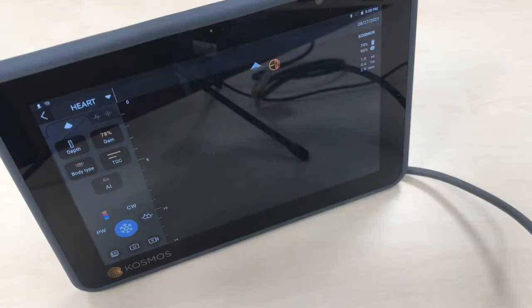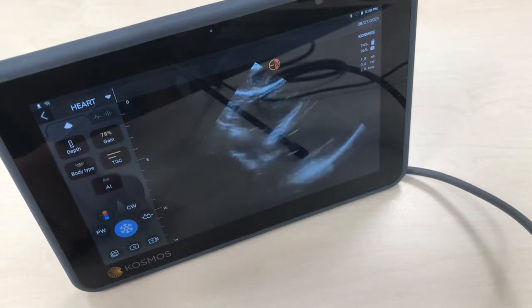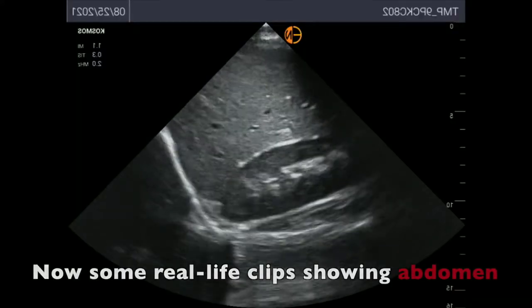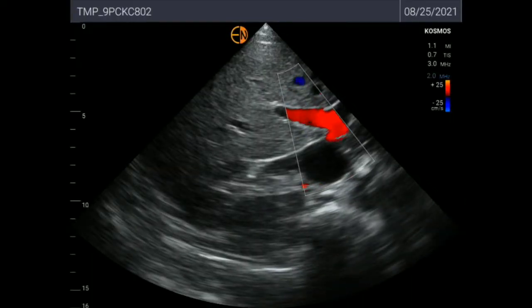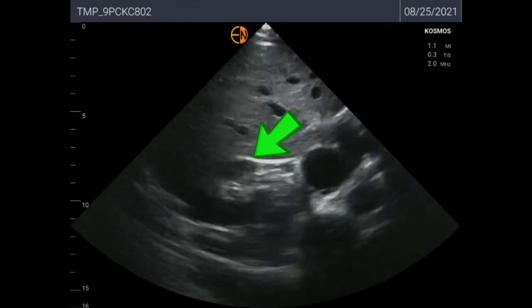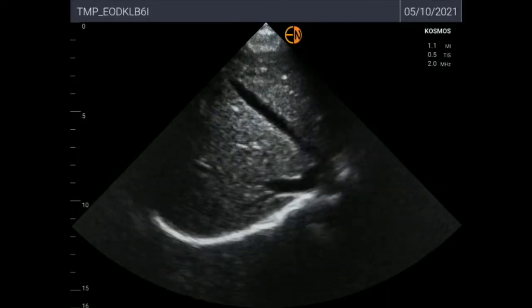We can also obtain a subcostal view. And here I'll show you abdominal images for those interested. This is the liver-kidney interface at the right Morrison's pouch. This is a transverse abdominal view showing hepatic flow and inferior vena cava. And this is a quick fanning around the right kidney from superior pole to inferior pole, and finally a close view around the hepatic parenchyma and vessels.